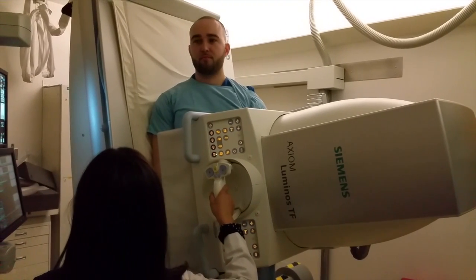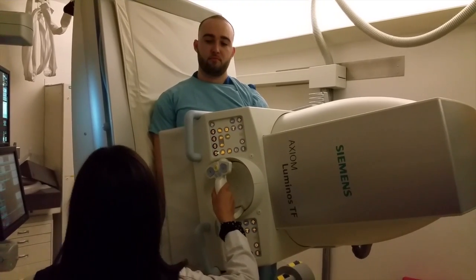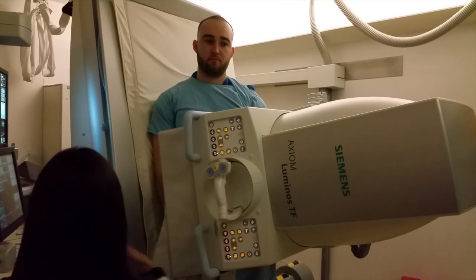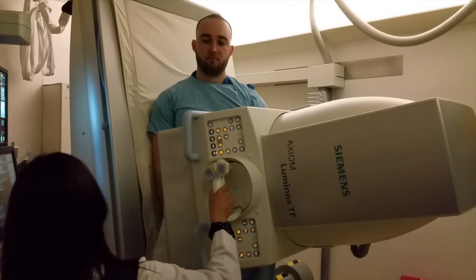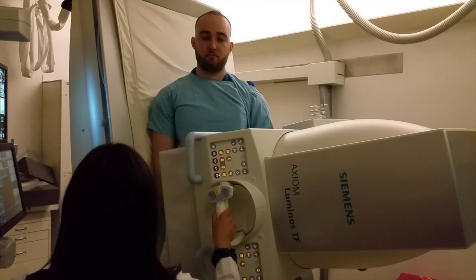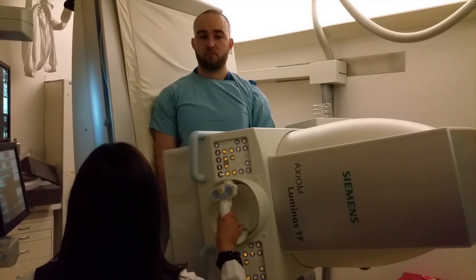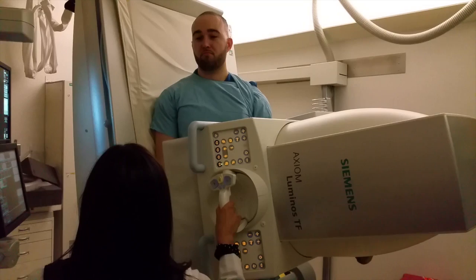If the exam is a cystogram, have the patient void in the restroom and obtain a post-void image to include the bladder and kidneys. For voiding studies, older males may be able to void more easily if the fluoroscopic table is tilted to 30 to 45 degrees, or if they're able to stand. The patient is instructed to void or urinate while under fluoroscopic observation.